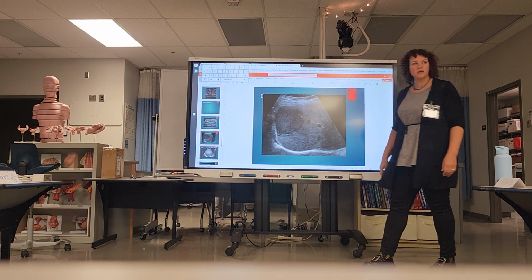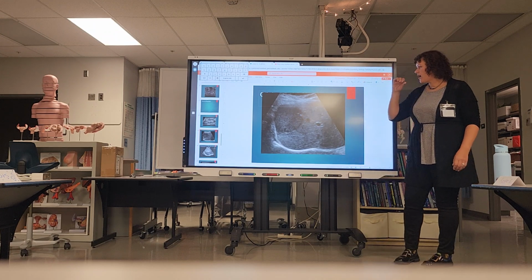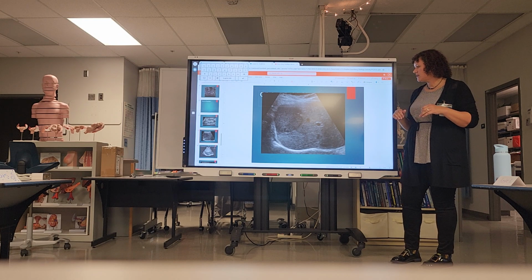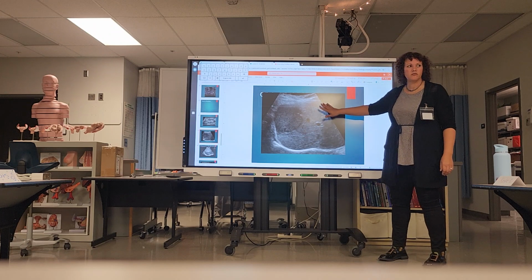Would you say heterogeneous or homogeneous for the mass? You wouldn't normally describe a mass as being homogeneous. You can, but homogeneous is normally reserved for normal organs, like liver tissue.